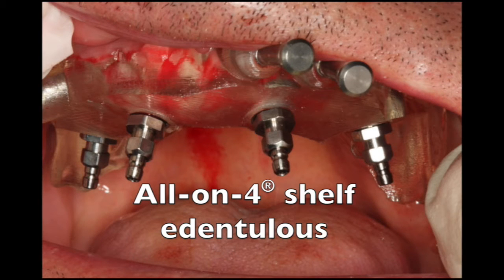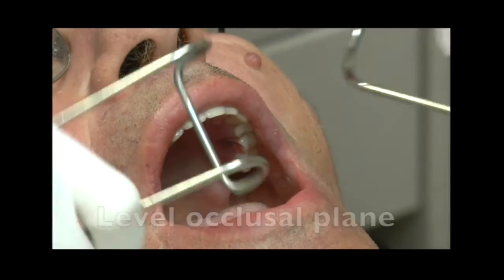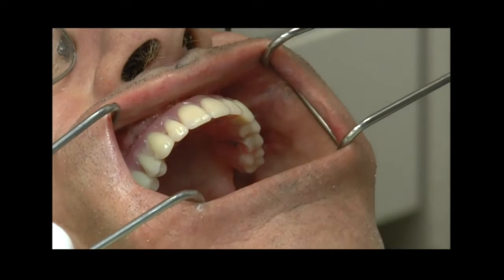During this concept the bone a lot of times has to be reduced down. So we have to figure out where we want the implants in order to make this All-on-4 shelf, which is so important for prosthetics. We want to plan for prosthetics because we want to create enough space so that we have a bar, the multi-units, the teeth, and the acrylic all in a conventional manner so that the multi-units are about one millimeter below tissue and the bridge is slightly convex so we can make it very cleansable.